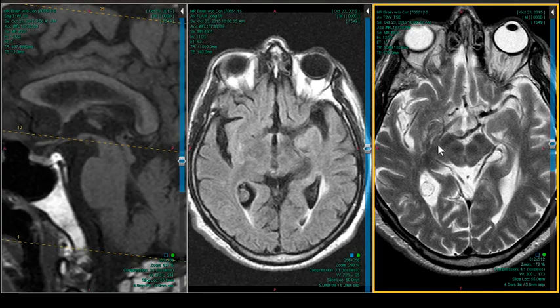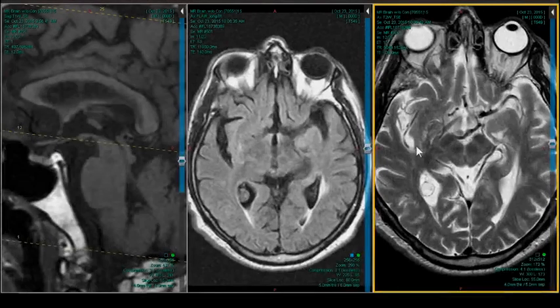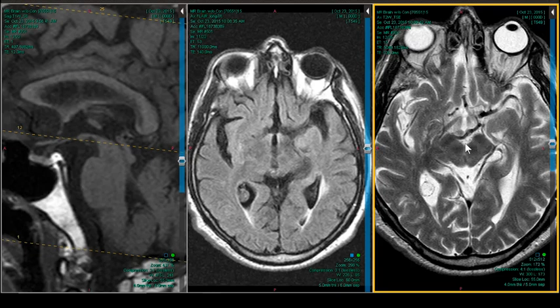But one finding I find helpful now that I'm a little bit older is this widening, the splaying of the interpeduncular cistern in the axial projection, because a lot of us gravitate to the axial from our prior experience in CT. We kind of shy away from the projections that we didn't grow up on. Now a lot of you are trained in sagittal, so you younger radiologists are more comfortable with it. But this widening of this angle, the so-called crural angle, is another sign of midbrain atrophy. And the patient does have brain iron in the substantia nigra and red nucleus. It's present. But the key is the sagittal. Shall we move on? Okay.